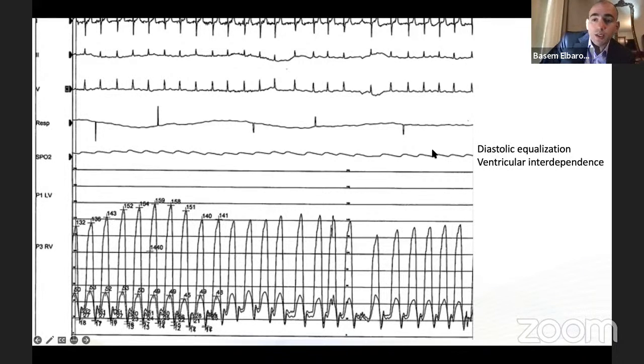There's really no good spot to measure a blood sample for mixed venous O2 sat when you're dealing with a shunt. So if it's a shunt where you're trying to calculate the Qp:Qs, then you really need to do the IVC and SVC and use the Flamm equation. There's no real spot where you can accurately measure a blood sample and say that's the mixed venous. That's the problem, and this is where the equation goes in.